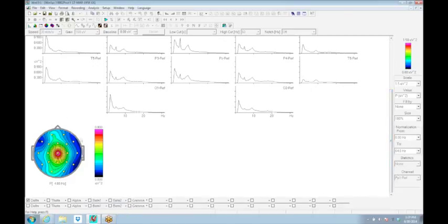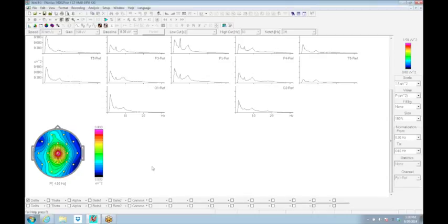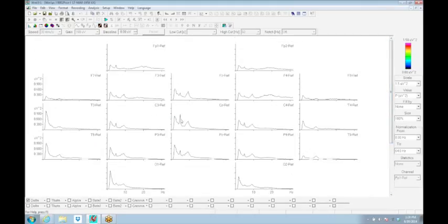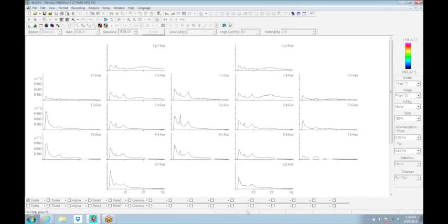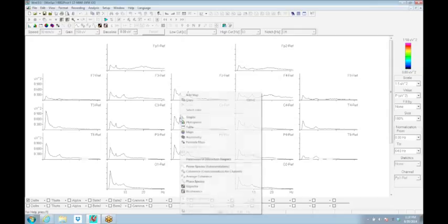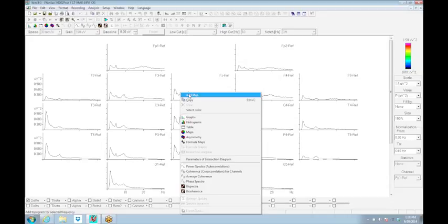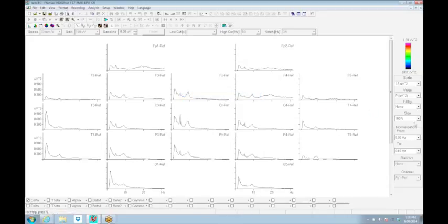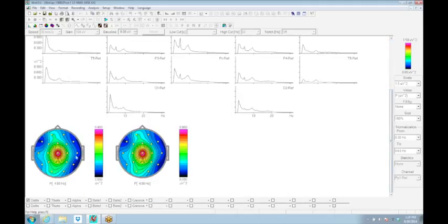I want to step back for a second and explain how Jay got that map to happen. When he clicked on a particular point in the spectral, you got your crosshairs there. If you then right-click on your mouse, down at the bottom you'll get your microvolts and also the hertz at which that crosshair is at. You can see in your y-axis and x-axis that that would match up. Then if you right-mouse click at that point and click Add Map, it creates a map down below of the feature that you had just isolated.